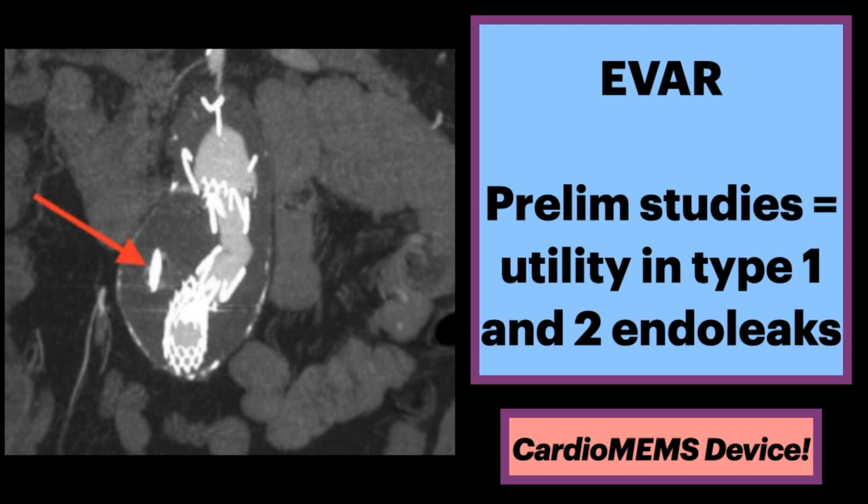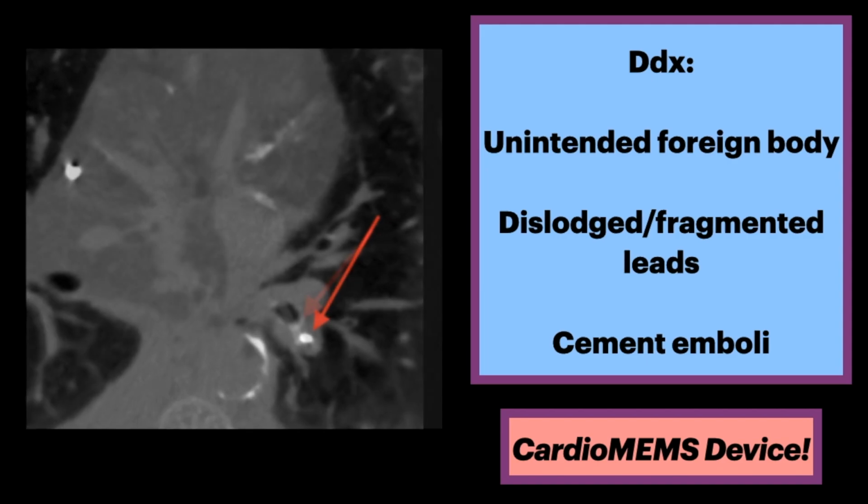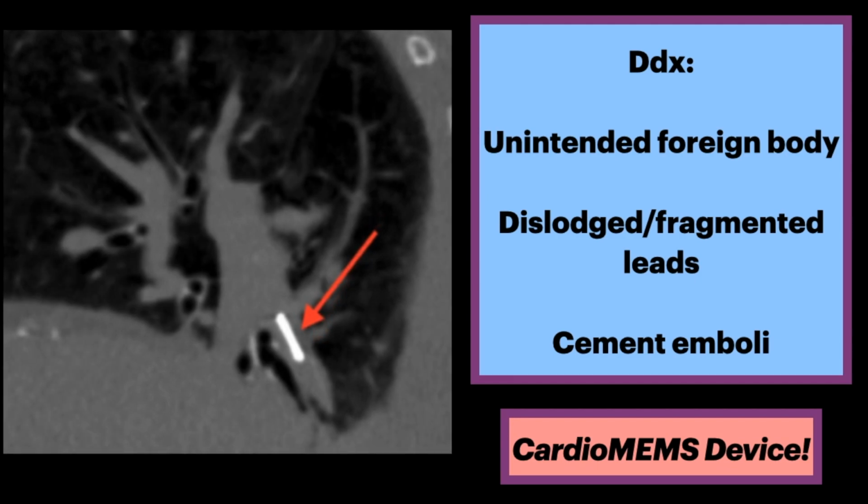As with the device in heart failure, complications are typically related to device placement or device migration. In terms of the differential, consider other unintended foreign bodies. For example, consider dislodged or fragmented pacemaker or catheter leads. Also consider cement pulmonary emboli from vertebroplasties. The main difference again is the large nitinol loops on either end of the sensor that secure it into the branch pulmonary artery by their outward force.